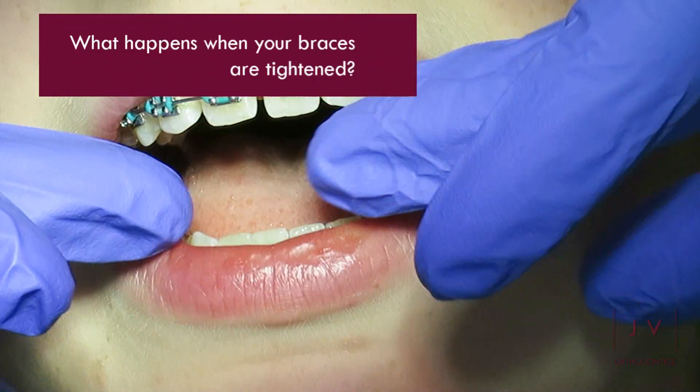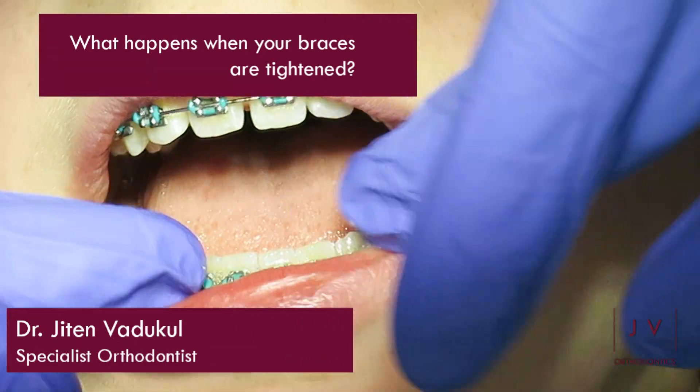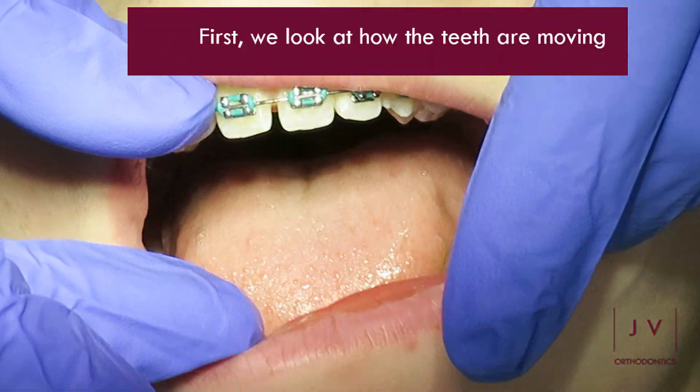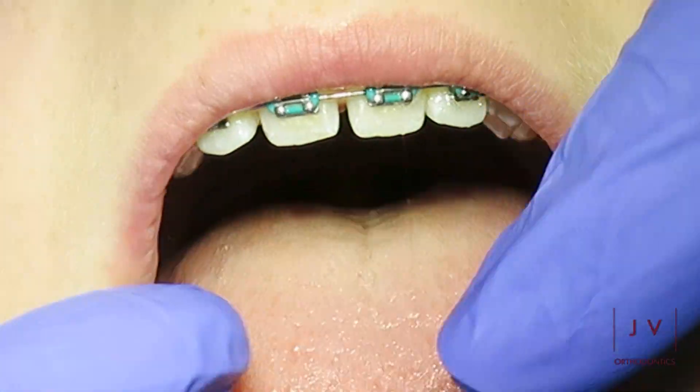Hi everybody, it's Dr Jeta Nvadakor here and in this video I'm going to show you what happens when you have your braces tightened. The first thing we do is we look at how the teeth are moving and if they are moving as per our orthodontic plan.